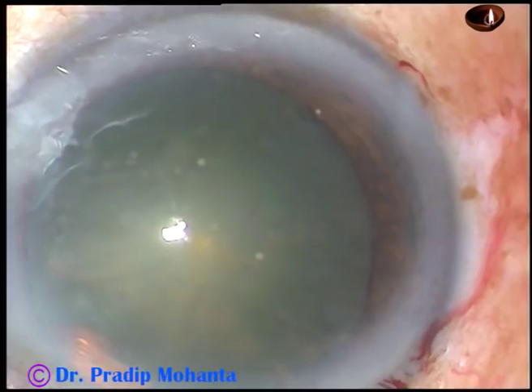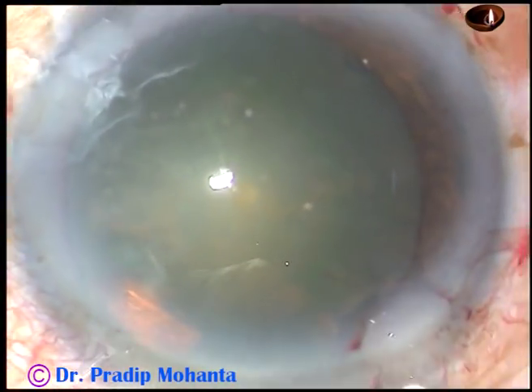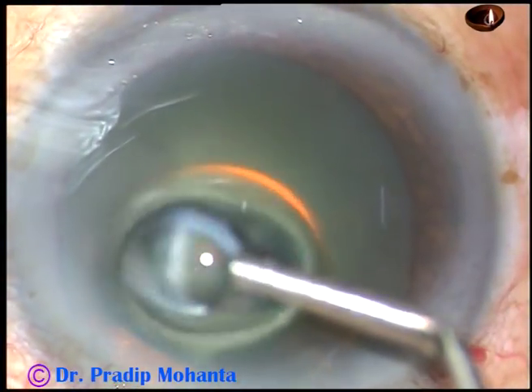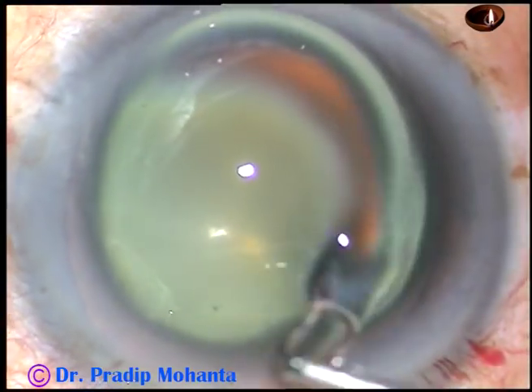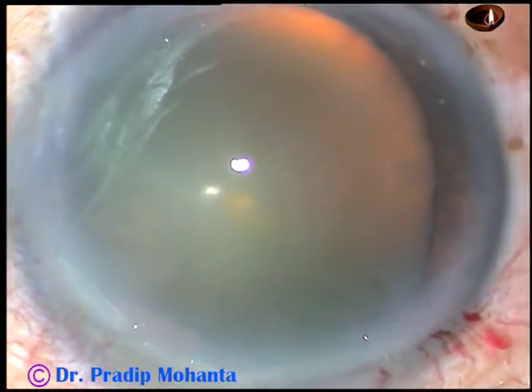And now, in this case, I am going to do capsulorhexis with the needle itself. Inject some viscoelastic substance. You can apply some HPMC over the corneal epithelium — it will improve visibility.